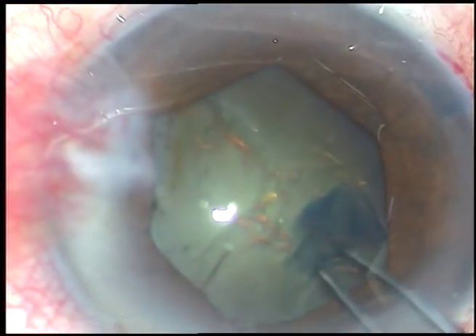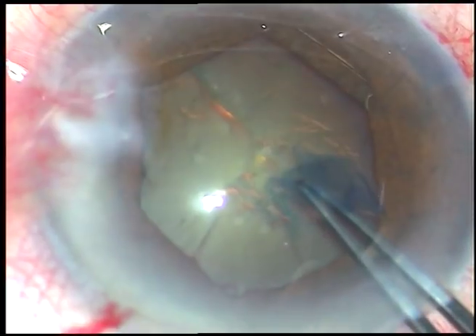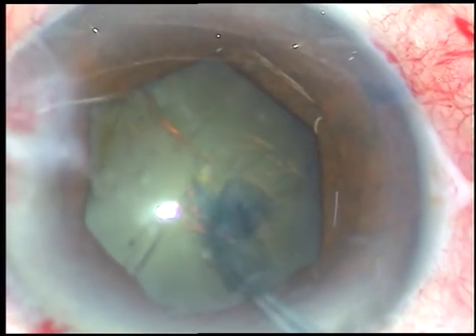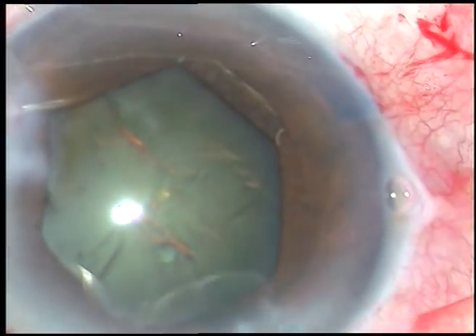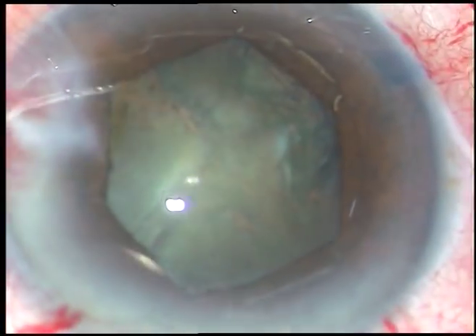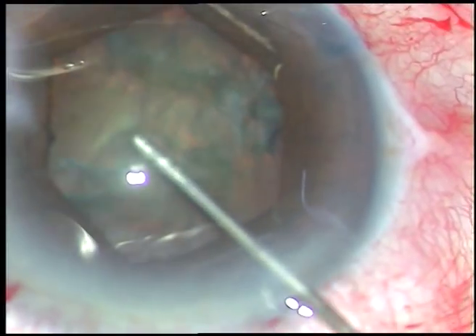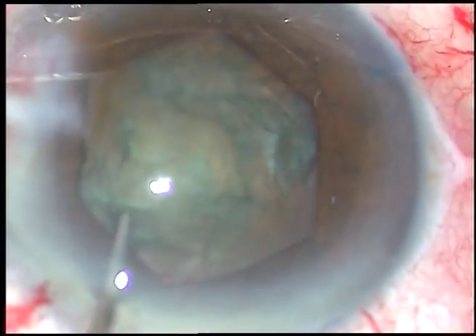By this time the rhexis has been done — this is an edited video. The capsulorhexis is completed. Hydrodissection is done. This is a 27-gauge cannula and BSS is being used to do hydrodissection. The nucleus is mobilized.